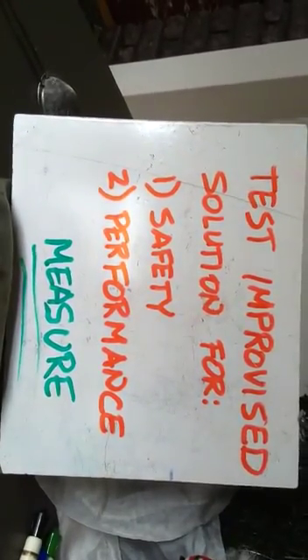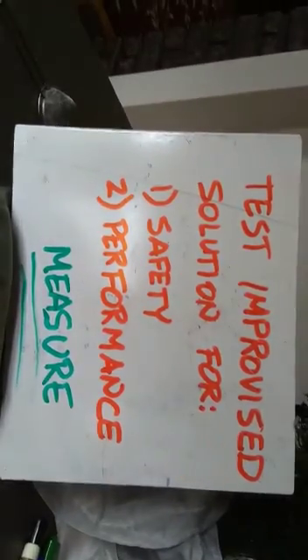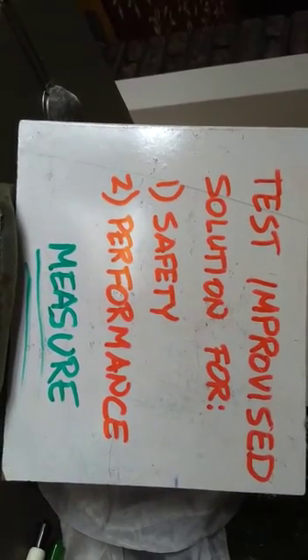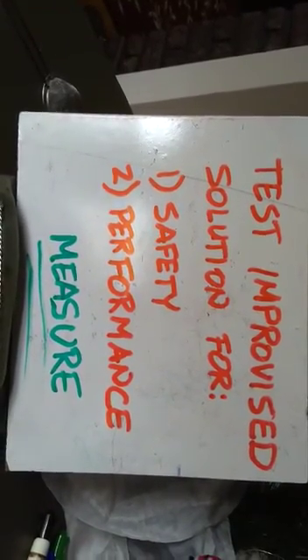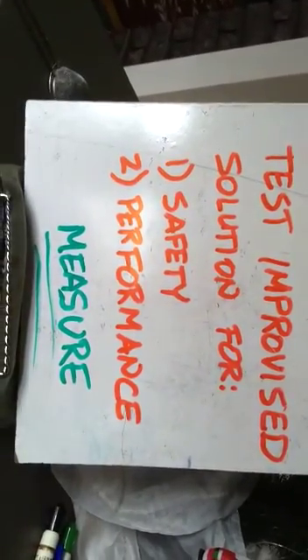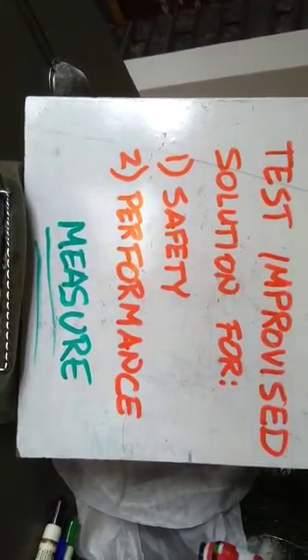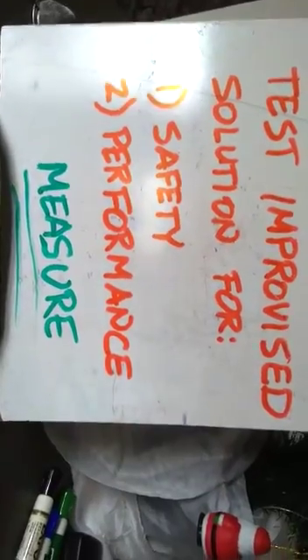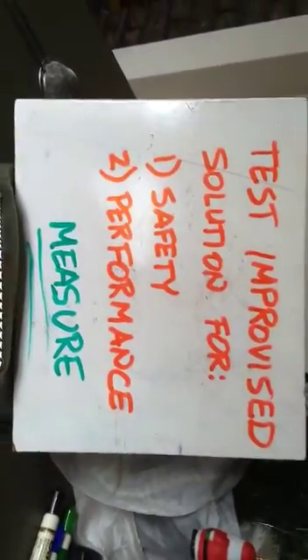We want to see whether or not we can replace the cabinet filters with two different types of materials. And I'll describe later why we're looking at these two potentially different materials than came with the manufacturer. In some cases, maybe you just don't have access to anything like the original filter. But it's also important to understand the function of that initial filtration system. And that is basically the high efficiency particulate air filter. That is the first stage of every concentrator to remove impurities, especially particulates.